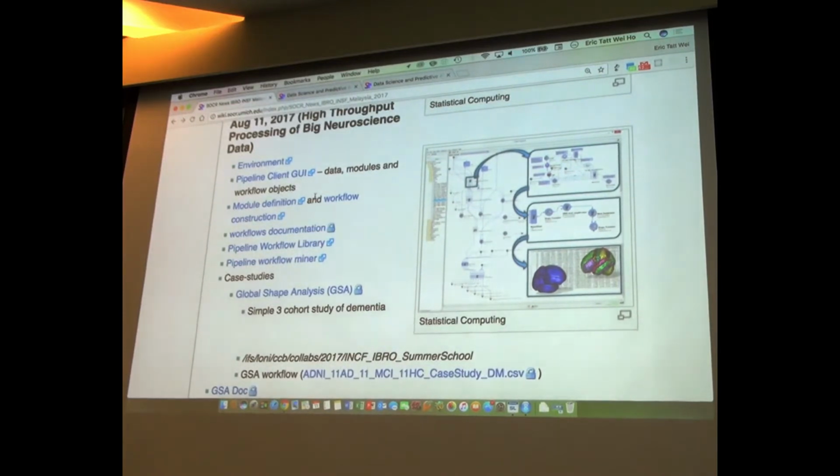So in '99, believe it or not, a long time ago, almost 20 years, we made a decision to try to optimize this and develop a graphical workflow environment where these scripts become graphs. The nodes are the individual processing units that you call, and the inputs are all the inputs that go into the scripts. The outputs are everything that comes out of the script. Every pipeline can be implemented more efficiently as a script, but not vice versa. Not every script is pipeline implementable. So, you know what I'm saying.